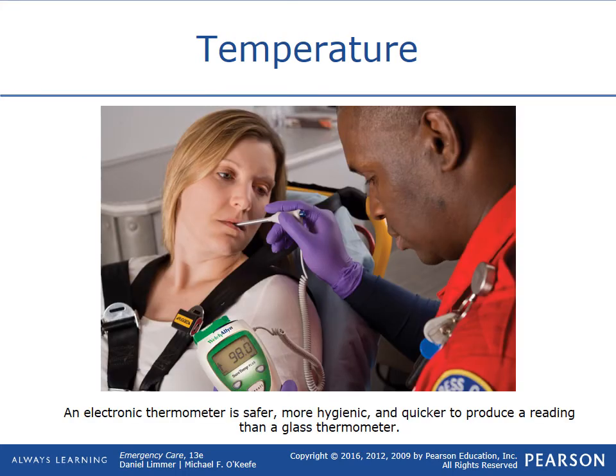As you see, taking the temperature in the mouth is one of the other best ways after rectally. So generally in order, it's rectally, in the mouth, in the armpits, on the head, or using the infrared scanners.